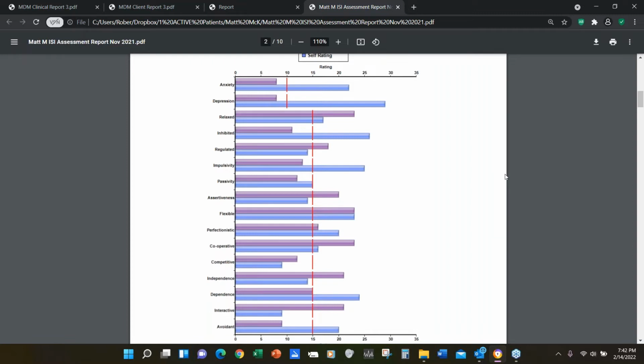And there's one exception to that. Somebody came in on a Thursday and they wanted to get this map done over the weekend so they don't have to skip any work. I'll tell them I'll map them and I'll give them a preliminary overview, but I will not interpret it until they've completed all the other information, the ISI, the CEC, and all that.